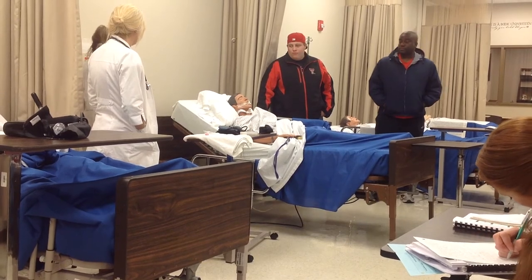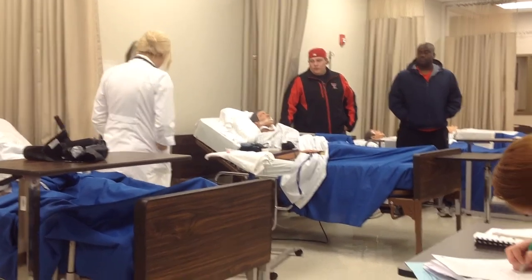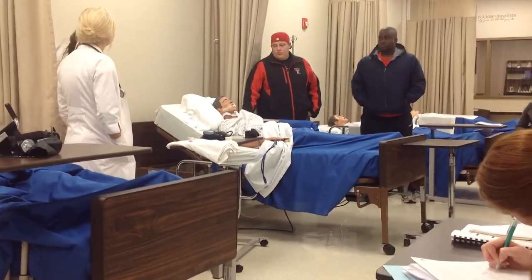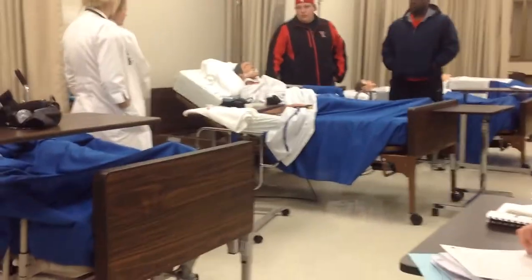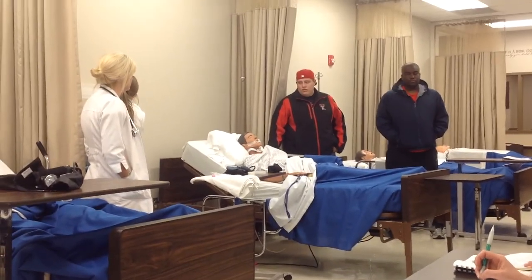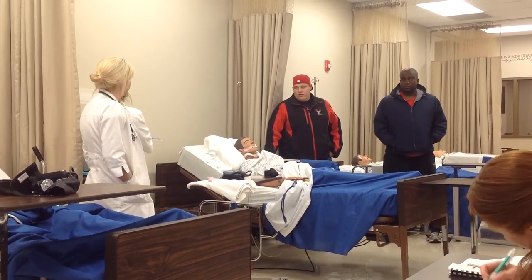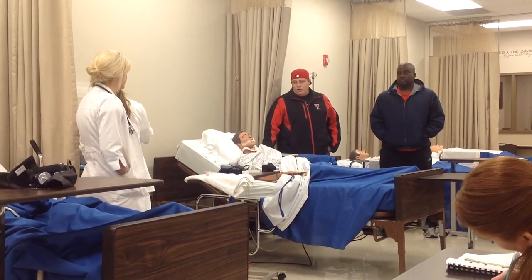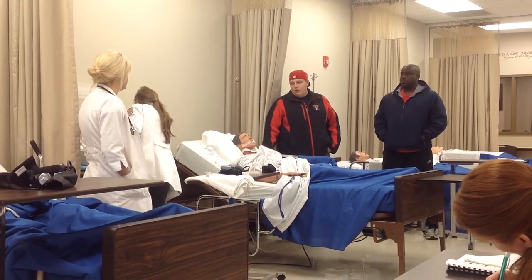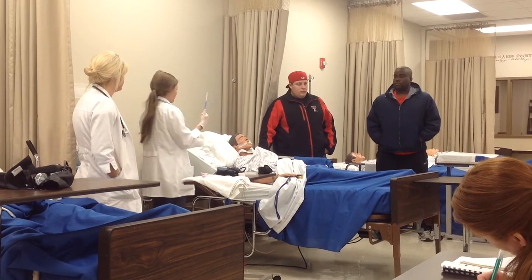Over here, you're going to attach this to this tube, and then I'm going to turn it on. I'm not going to leave it on the whole time, but I'm just going to show you, there's a switch over here, and you would suction up half of your water, so 50 mL, before you ever suction them. That's just to make sure it's working.